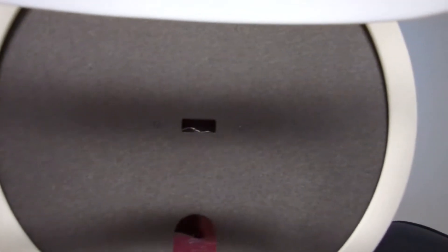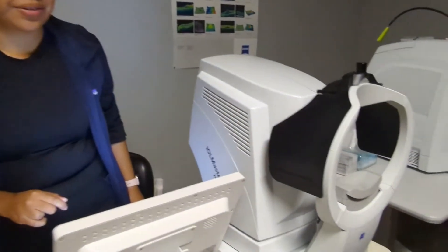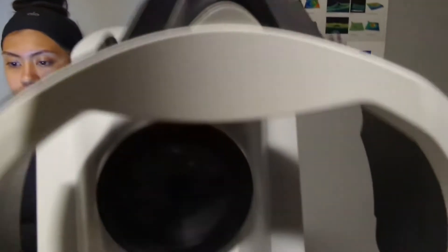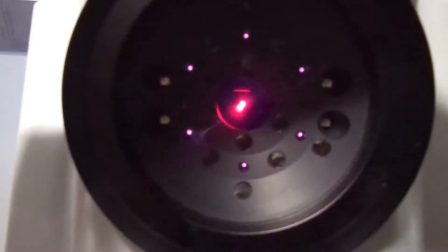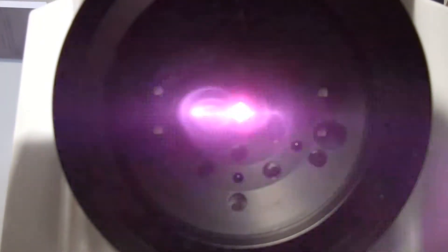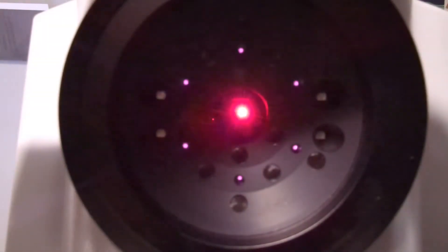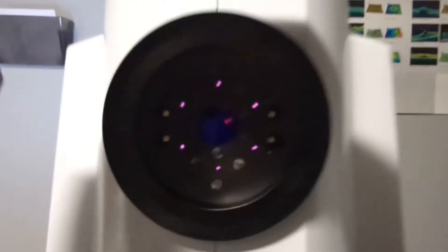Excellent, we got that. We're going to move on to this next machine here — go ahead and have a seat in the next chair over. Same thing here: place your chin on the chin rest, forehead against the bar. You're going to see a little red dot. Hold it right there. Good job — same thing here with the red dot. I'm going to take one more picture, hold it. And then one more picture. Very good, go ahead and sit back — we got what we needed.